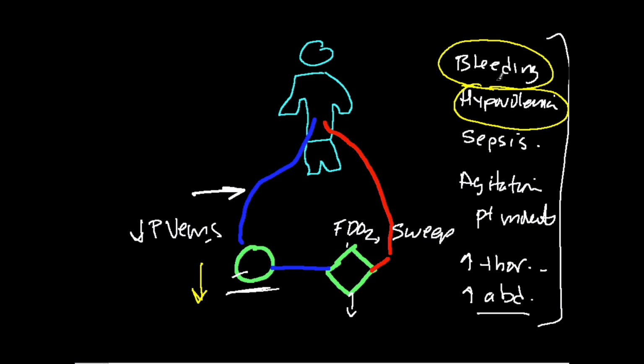It's really strange. These patients have pretty normal in vitro parameters of coagulation, be it TEG, INR, platelets, etc. But as a whole organism, they're out of whack and can bleed pretty much anywhere. It's really kind of a daunting task.